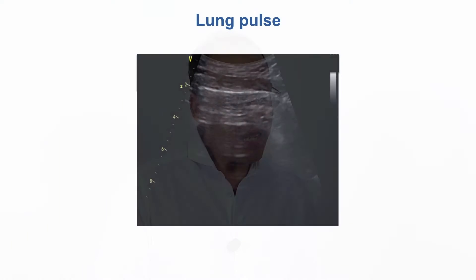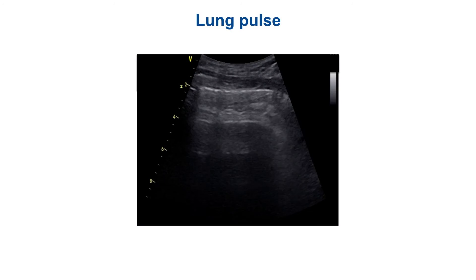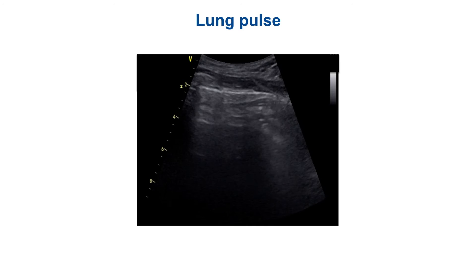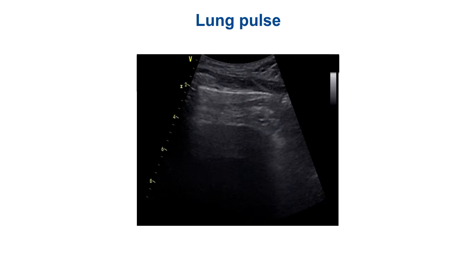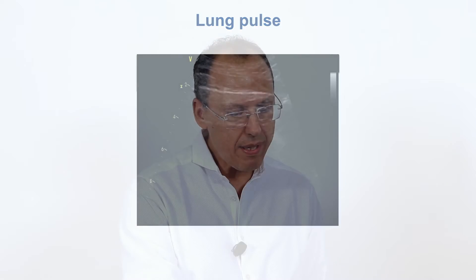Look, if I ask someone to stop breathing for a few seconds while I'm scanning the thorax, I will see the lung sliding progressively disappearing and the lung pulse progressively becoming more evident. You see it? Yes, but it's not the lung that is moving — it seems rather that the transmission of the heartbeats to the chest wall through the lung.